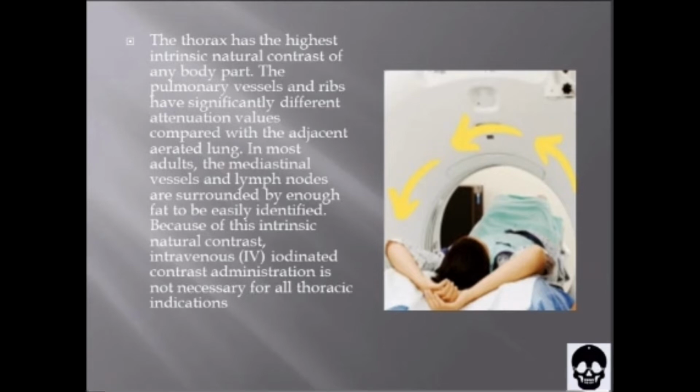The use of IV contrast material is typically requested by the radiologist to differentiate vascular from non-vascular structures, particularly lymph nodes, to evaluate cardiovascular structures by seeing inside of these structures, and to further characterize lesions by observing their pattern of enhancement.